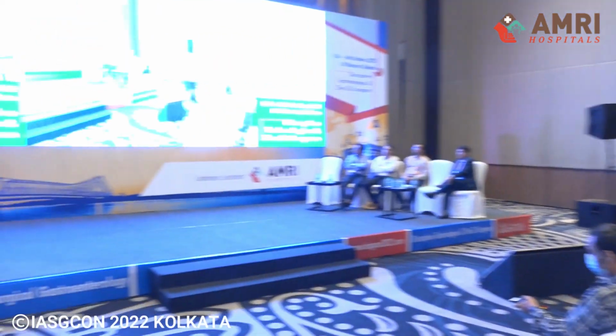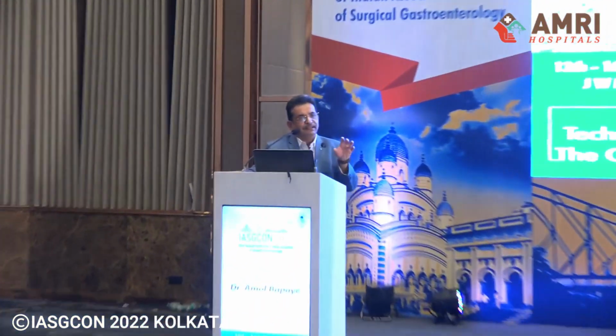Sir, regarding that gastroenterostomy, the jejunum is a mobile structure. So how do you fix it while doing a gastrojejunostomy? Or is it a gastroduodenostomy? Okay. So it's not actually a gastroduodenostomy, but it is not a gastrojejunostomy either. We actually target the DJ flexure because there the jejunum is relatively fixed. It is a gastroenterostomy. That is the reason we call it a gastroenterostomy. It's not a gastrojejunostomy or a gastroduodenostomy. But at the DJ flexure, it is fixed.